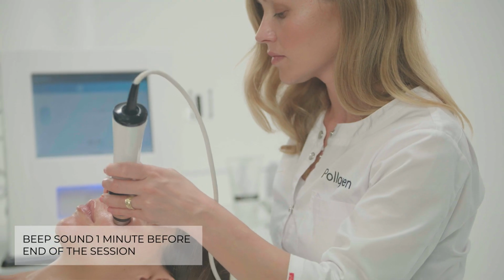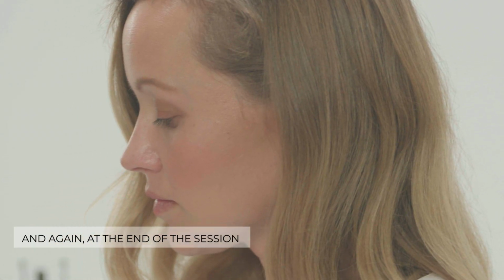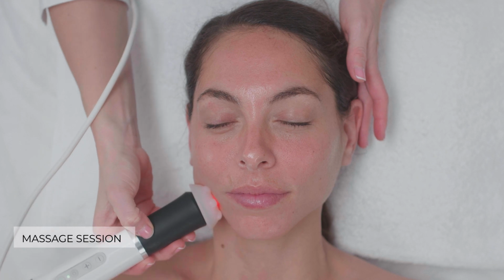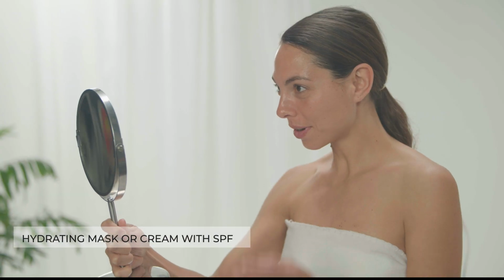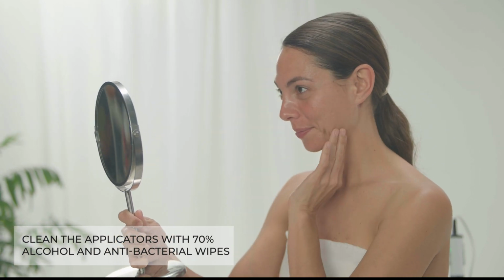A beep will sound 1 minute before the end of the session, and a final beep will sound when the session is completed. You may finish the treatment with the massage session. It is recommended to use a hydrating mask or cream with SPF for post-treatment. Clean the applicators with 70% alcohol and antibacterial wipes.